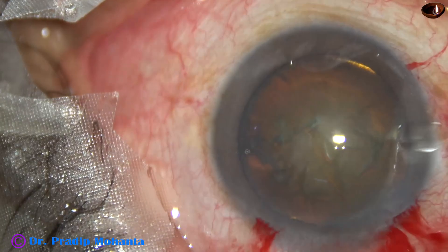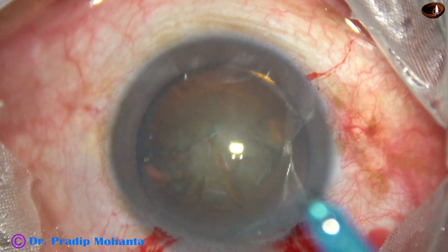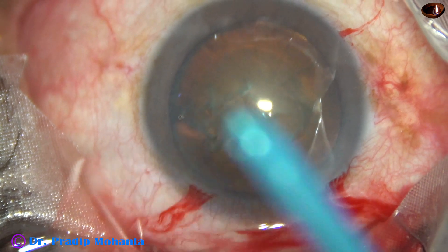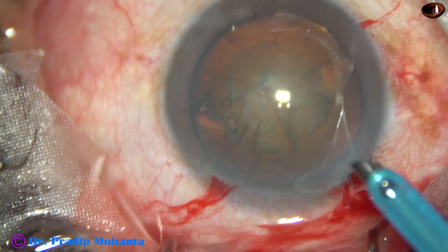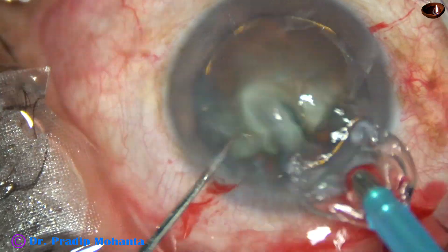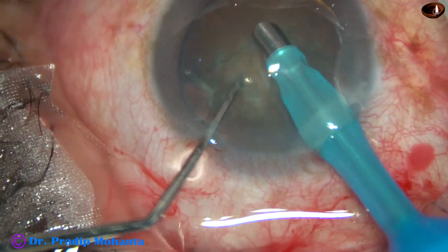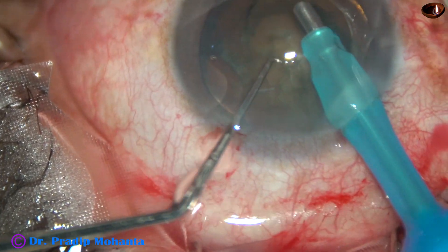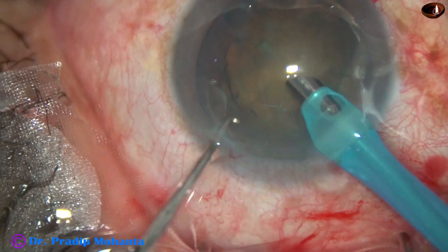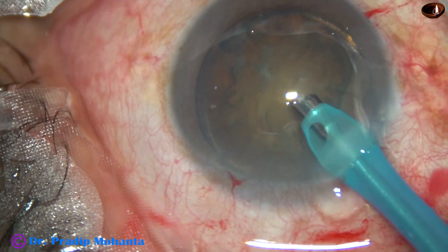2% HPMC is injected again to fill up the anterior chamber. The tip of the phaco handpiece — the tip of the phaco needle — is introduced into the anterior chamber. This is a chopper designed by me; it is just like a Sinskey hook. Some superficial cortical lens matter is removed.